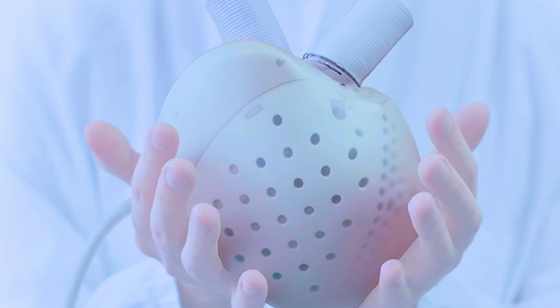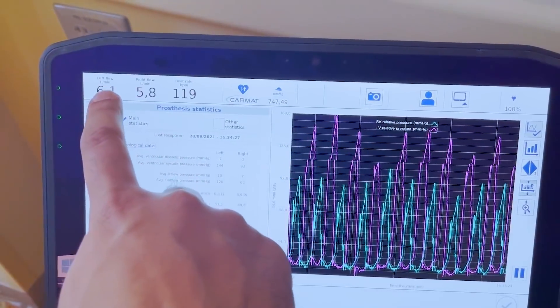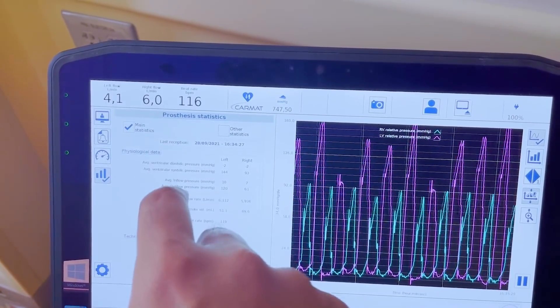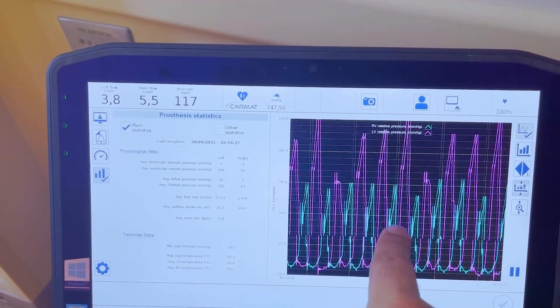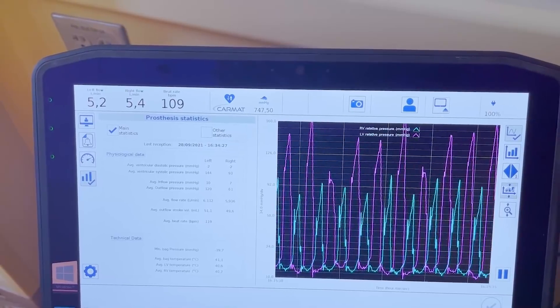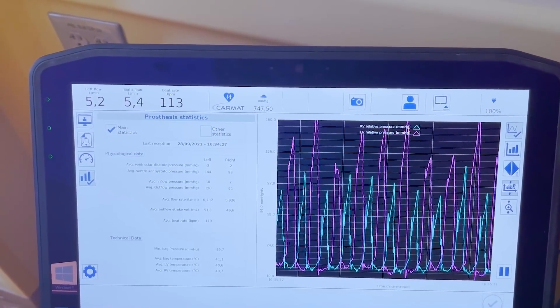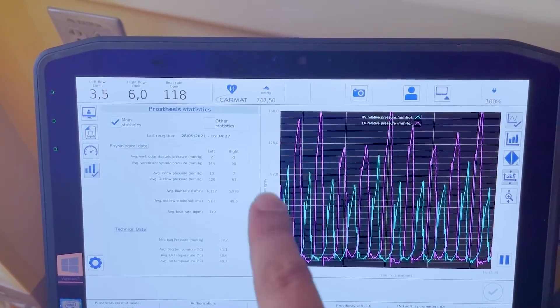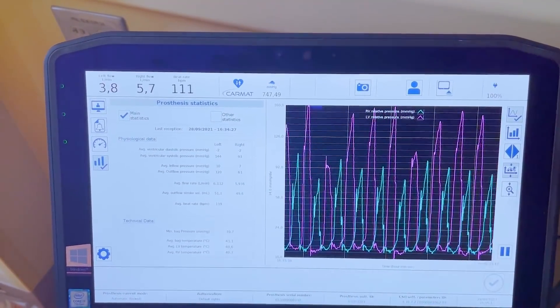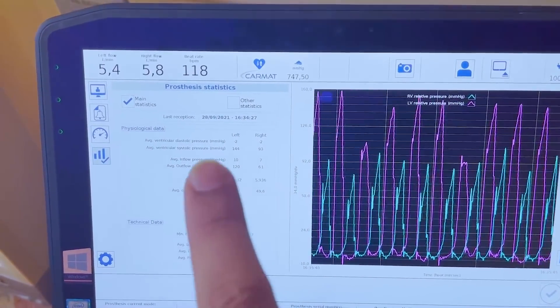Alright guys, this is the Total Artificial Heart. So you see LV flow and RV flow. This is going through the left ventricle, this is the right. See, the purple lines are the left ventricle, blue lines are the RV flow, and the heart rate is being decided based on the outflow from those parts.